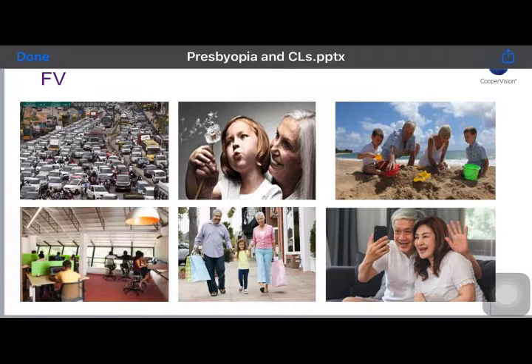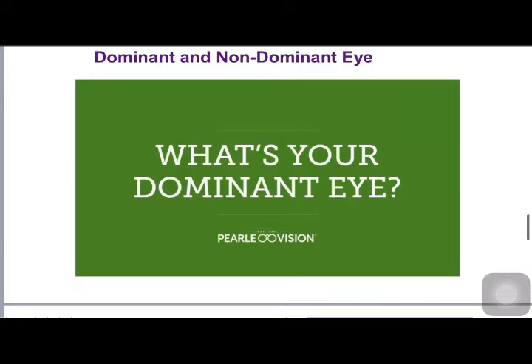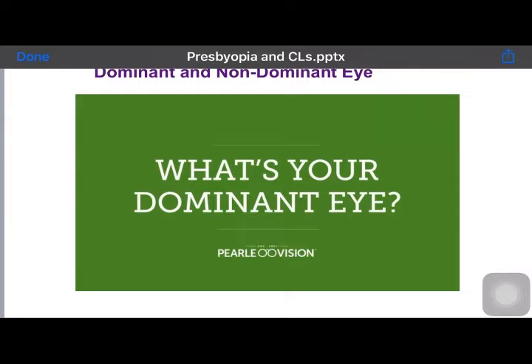Now, after you have understood their lifestyle needs, and after you have understood or guesstimated their functional vision, you need to find out the dominant and the non-dominant eye in your patient's eyes. Now, the dominant and the non-dominant eye is very easy to find out. You ask the patient to make a triangle with their hand, and you show them a target at a distance.